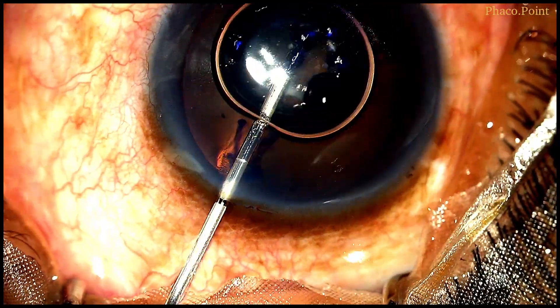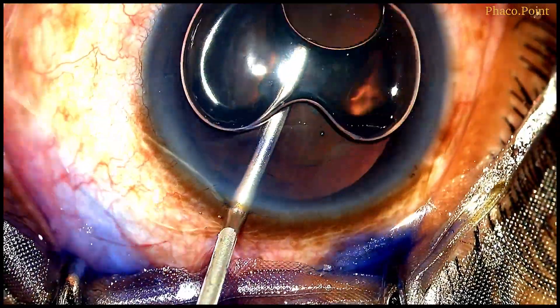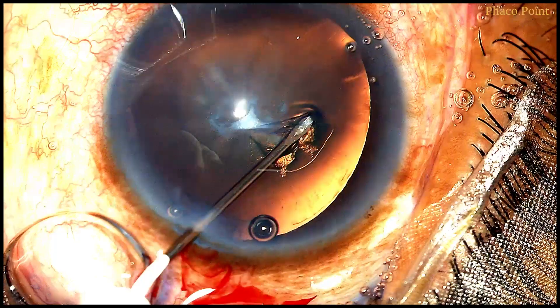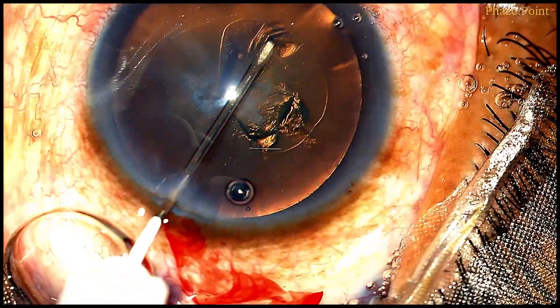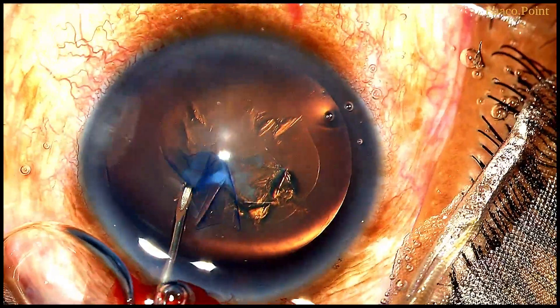Staining of the anterior capsule is a personal choice I have because I don't want any compromises whilst creating the rhexis. Whilst creating the capsulotomy, you need to be mindful that you end up with a capsulotomy that's at least 5 or 5.5 millimeters.